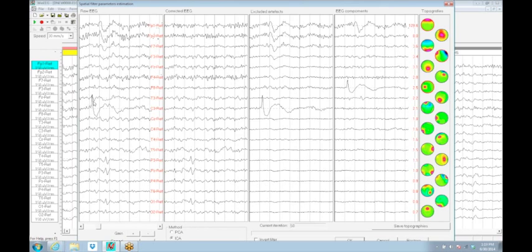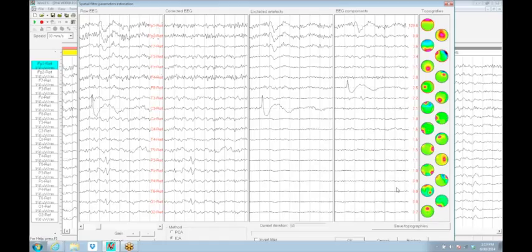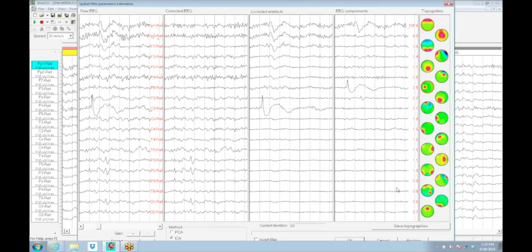Unlike the T3 getting rid of that little wander, this is pulling it out as a discrete click. It's pulling this out, not touching the little sharp stuff that happens to be in the EEG. It's only pulling out stuff that's focal to this C3 and that's a very isolated component. What these components are, are independent components that have been identified. The PCA didn't do a good job isolating these because the PCA assumes a Gaussian distribution. Although there are people that will argue that the EEG is Gaussian and that it's fairly evident that it's not.